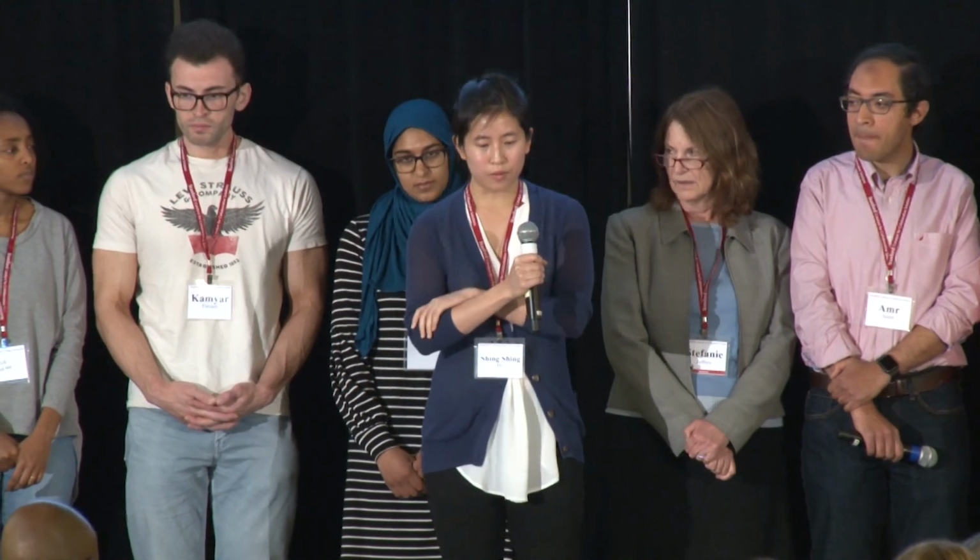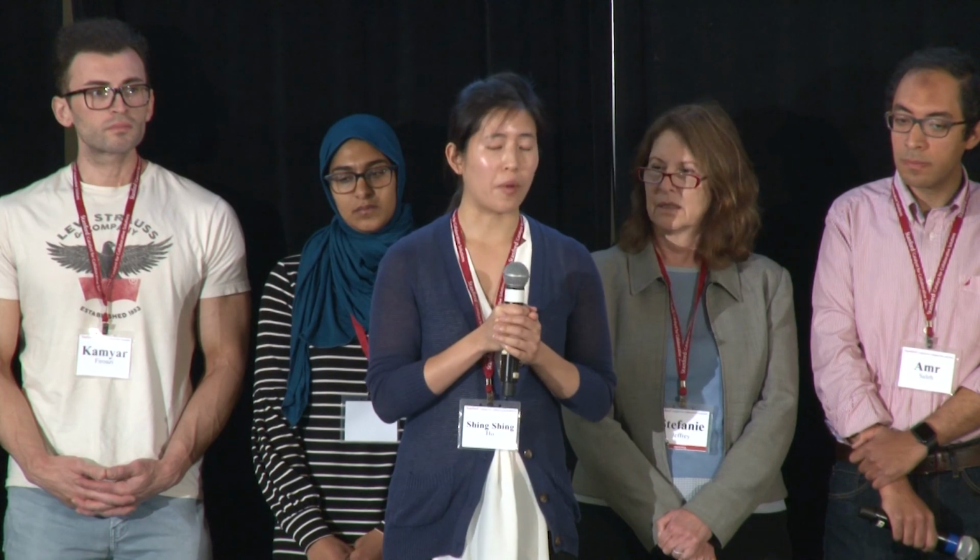So how much more accurate does your spectral analysis need to be for this to be commercially viable? Yeah, that's something that we're also trying to understand in the business aspect of it: what accuracy do we need to get to in order to actually change doctor behavior? And it's a trade-off between accuracy and the speed at which you get the information. So if we are able to get 98, 99% accuracy within the first day, it could change doctors' behaviors. Because the current state of the art is extremely accurate, but it takes several days to get. So there's a certain benefit to getting the information earlier.